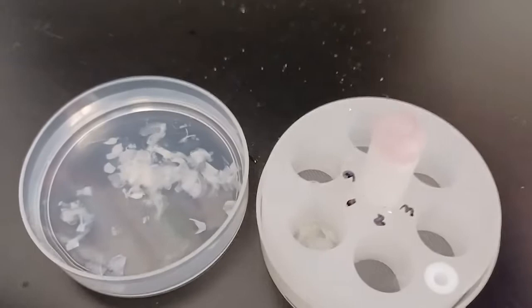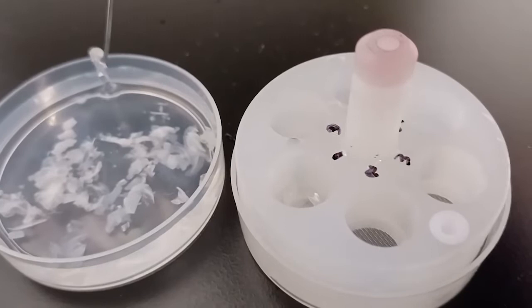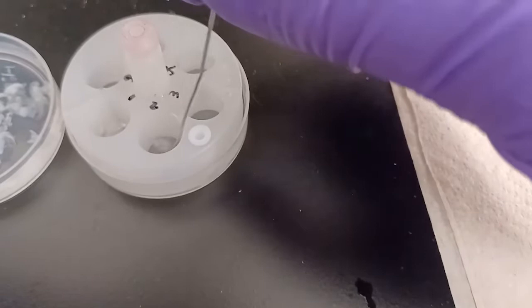Here I am isolating specific sections of interest and migrating them individually to the netted insert. In the same fashion as before, I try to reach underneath the sections and lift them up much like a sort of hanger, rather than dragging them across the walls of the basin.